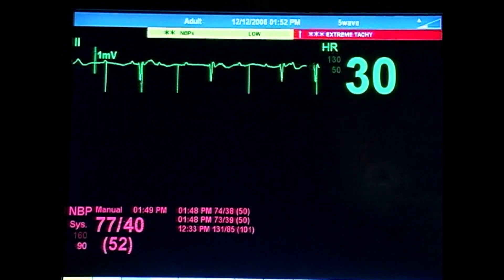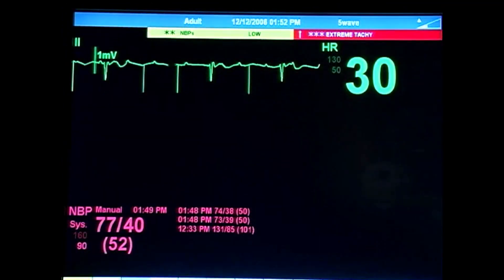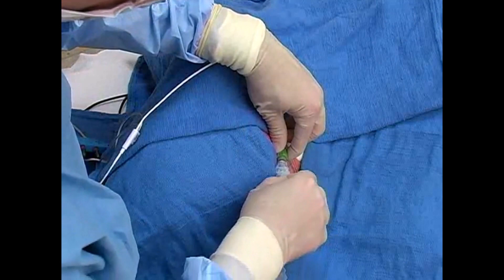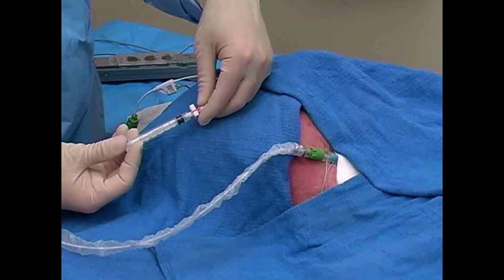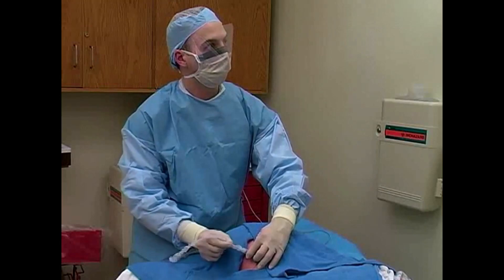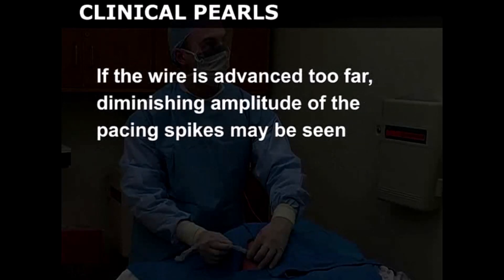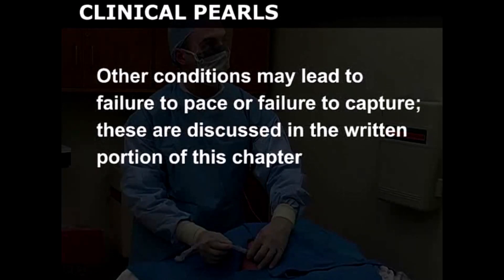If capture is not obtained after advancing the catheter a total of 40 or 50 centimeters, deflate the balloon by opening the gate valve and withdraw the catheter to the original position. Re-inflate the balloon and make another attempt at advancing the wire. Failure to capture may be caused by coiling of the catheter in the right atrium, or by advancement into the inferior vena cava or pulmonary outflow tract. If the wire is advanced too far, diminishing amplitude of the pacing spikes may be seen. A variety of other conditions may lead to failure to pace or failure to capture, and these are discussed in the written portion of this chapter.